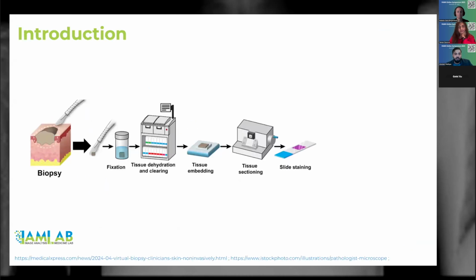First of all, we know that it all starts with the biopsy and then the data preparation. Even though there are standard protocols for staining the slides, due to different sites, different centers and different conditions, there are still variations in the staining pattern, differing from one center to another. Traditionally, pathologists analyze the glass slides under the microscope and render a diagnosis.